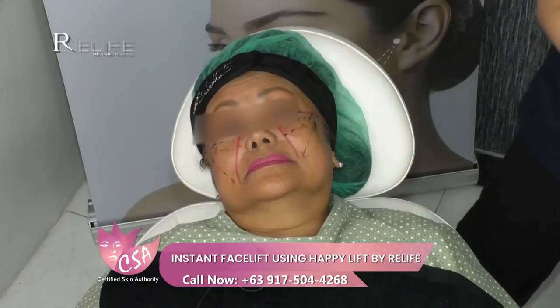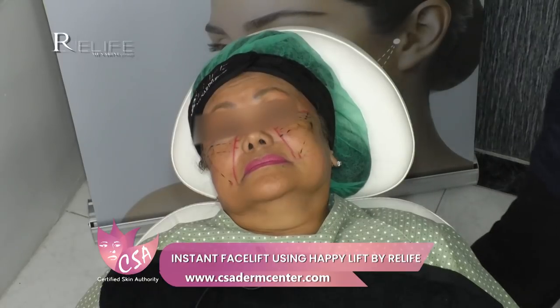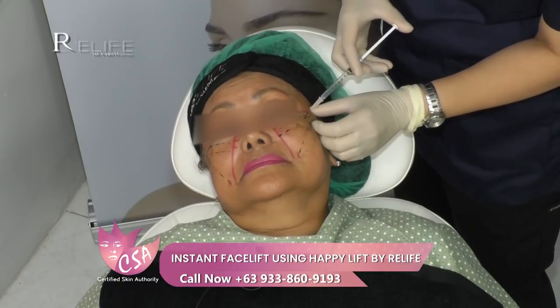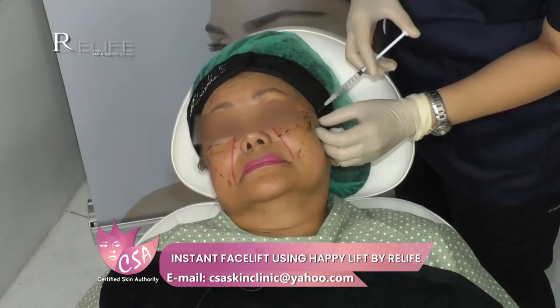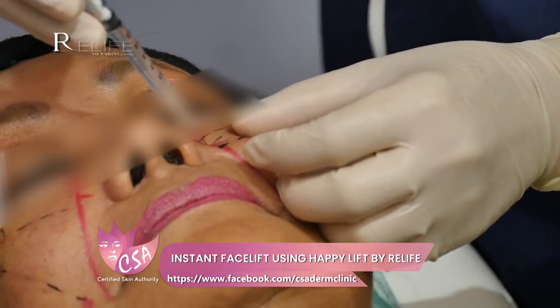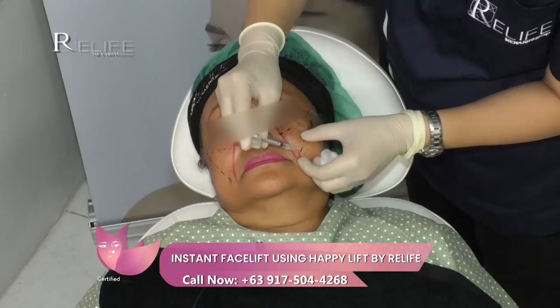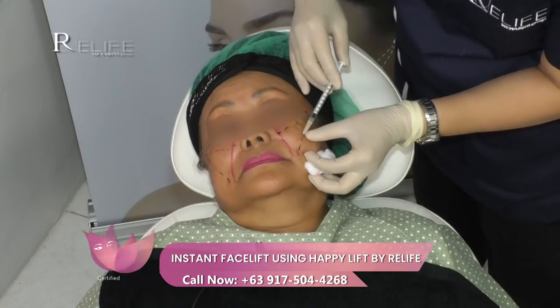We did the injection of the lidocaine earlier. We can still check the lidocaine injection. The entry point will be in the temporal region. I've already done the markings so I know where to insert the revitalizing threads. I'm adding a little bit more lidocaine as there's still some sensation. It's important to make sure the skin is fully anesthetized — it's tolerable, just some discomfort.